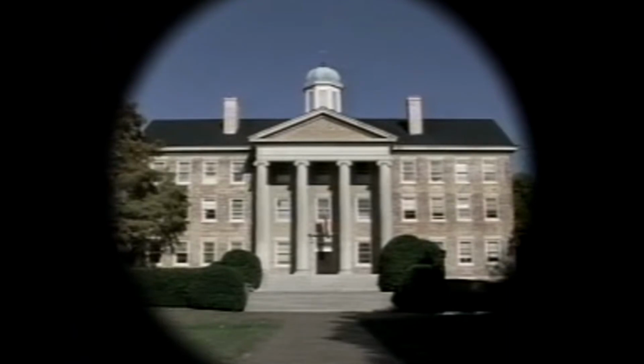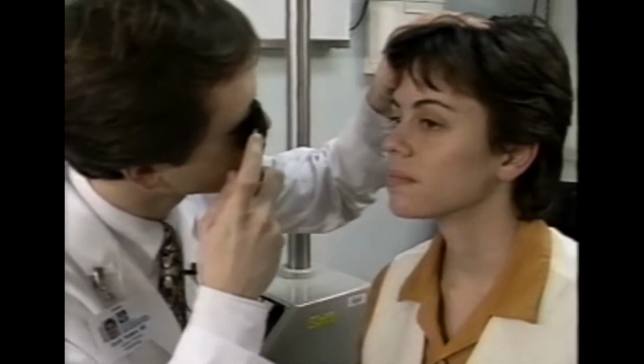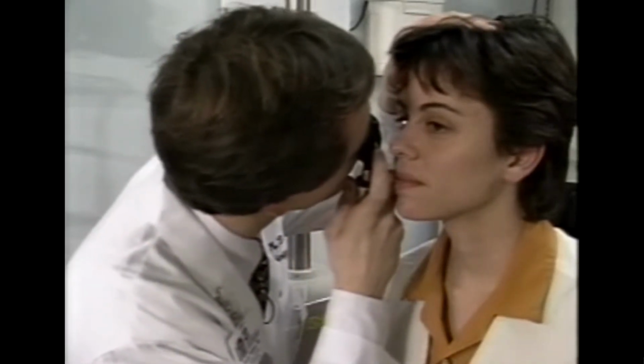I cannot overemphasize how important it is to get very close to your patient. You're trying to view the retina through a very small opening. This photograph demonstrates the enhancement of your view as you get close, closer, and closest. As you move slowly closer, refocus your ophthalmoscope until you have a clear view of the retina.